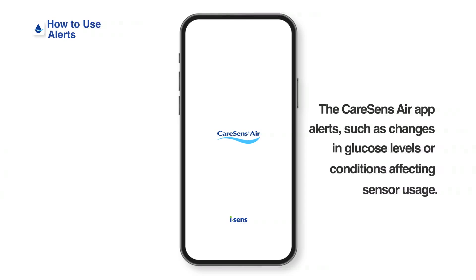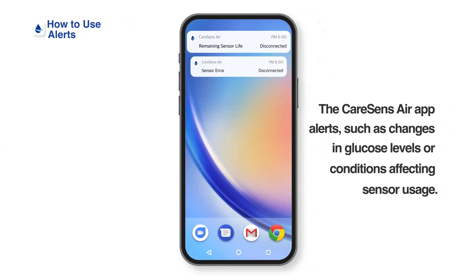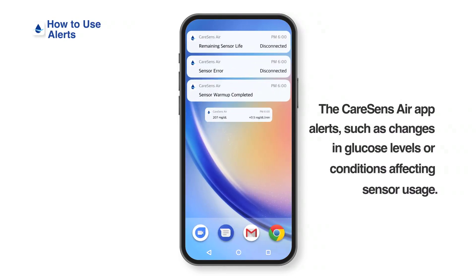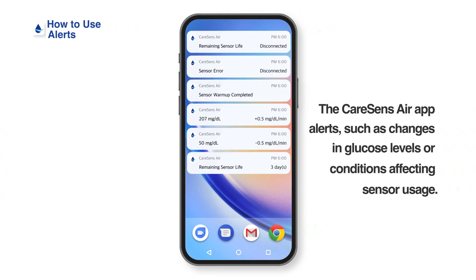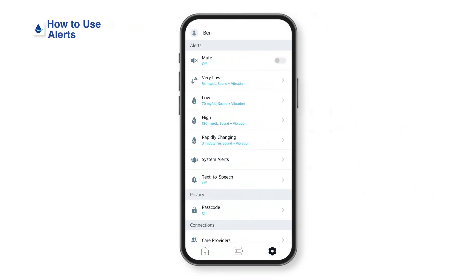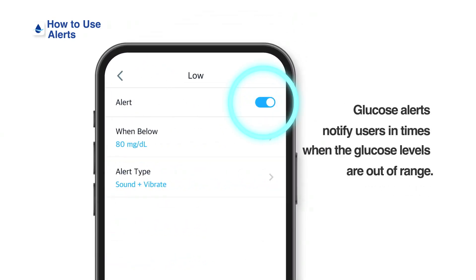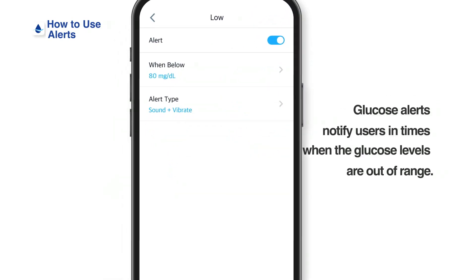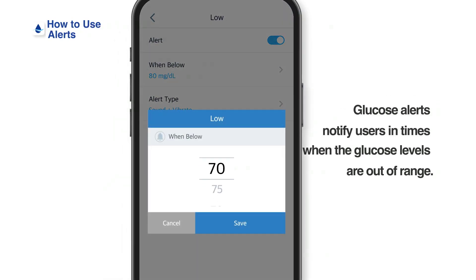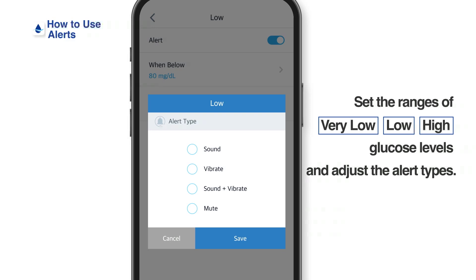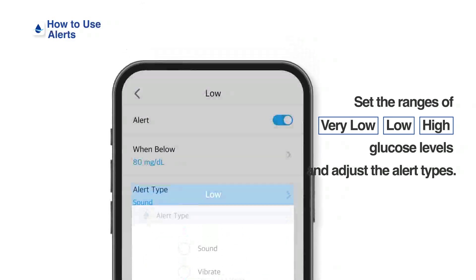The Kerasens Air app sends alerts, such as changes in glucose levels or conditions affecting sensor usage. Let's explore the types of alerts and how to set them. Glucose alerts notify users when glucose levels are out of range. You can customize each alert by setting the range of glucose level, alert type, and whether or not to activate them.